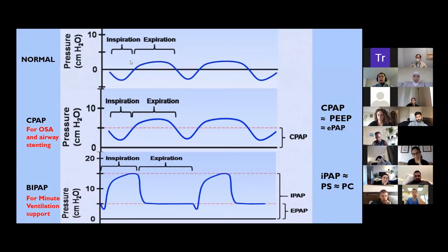That being said, all of you have become very familiar with COVID and I have seen a bunch of COVID patients, and very commonly one phenotype that we see is that they are extremely hypoxic, but they still are able to maintain a very effective minute ventilation. So you see patients that are hypoxic, but are breathing very deeply and very fast. Many of these patients are breathing at rates of 30 with volumes of 1,000. The patient already failed high flow with a non-rebreather, and now you want to start noninvasive ventilation until we intubate that patient.